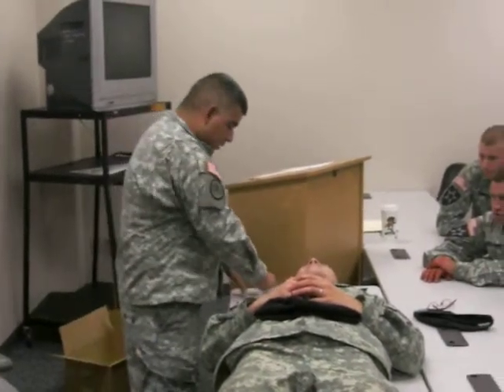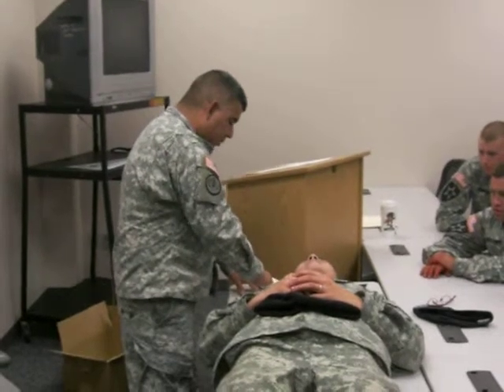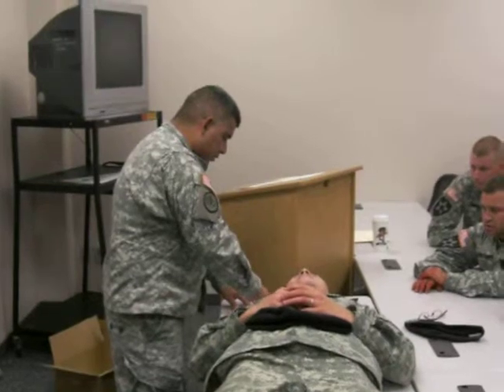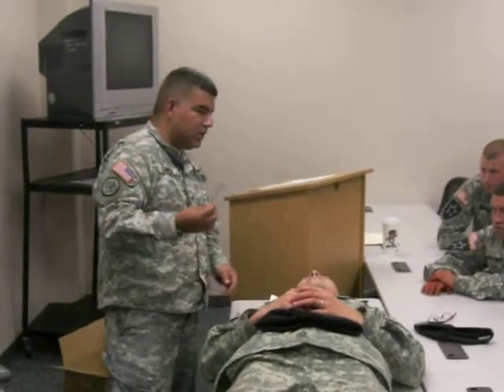Next thing we want to do is go ahead and lube it up. The more lube you have, the easier it actually goes in. All right, so we get this surgical lube and make it all nice and goopy.